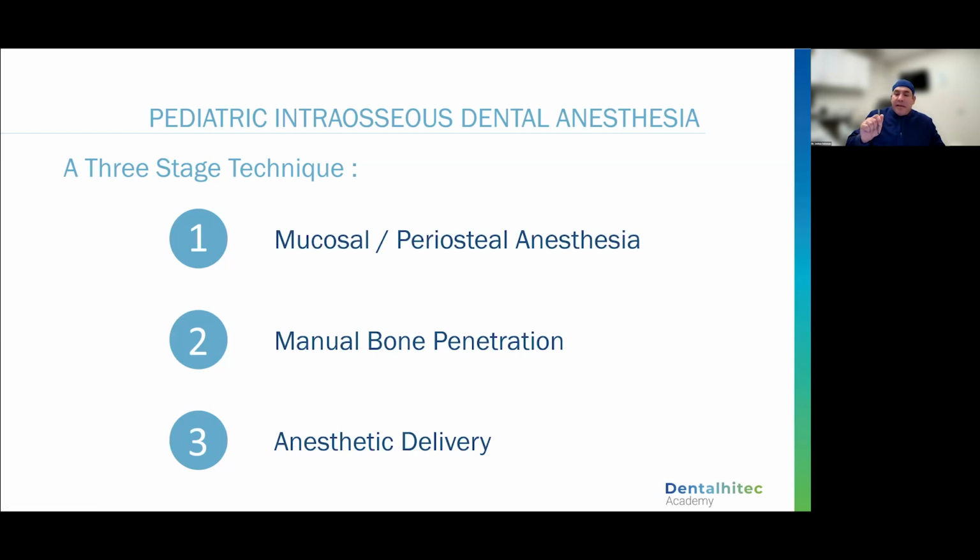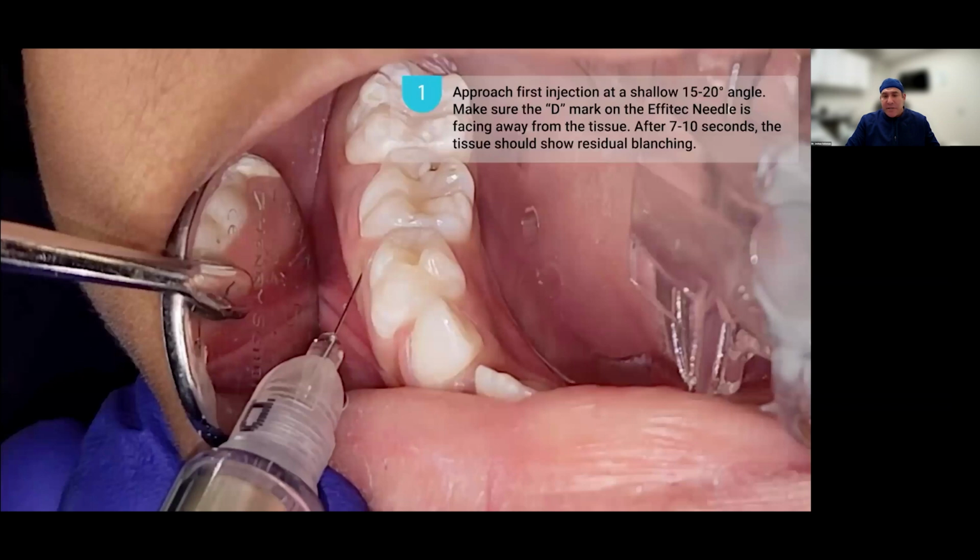Now, giving the anesthetic manually and with an electronic device are two very different things. And it's not only that. There's a large difference between electronic delivery of local anesthesia, and we will talk about that. And not only electronic, but a piece of hardware that is designed only for intraosseous delivery of local anesthesia.